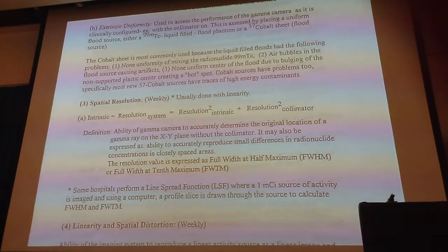So when I send it to you, you're not going to be having problems with 810 keV photons going through your gamma channel. Positrons it gives off, that's not a big deal. Either way, either the 511 or the 810 keV, they're both a problem. And what percentage of the cobalt 58 decay is positron emission? 2%. Is that a big deal?